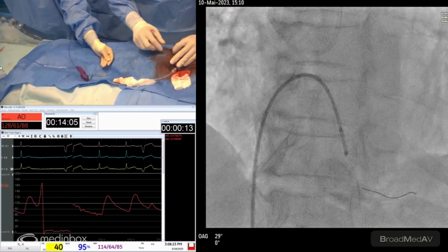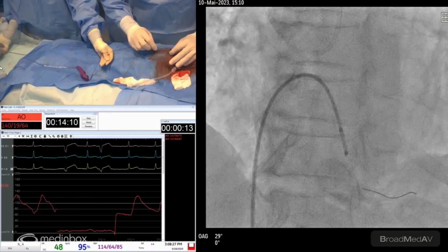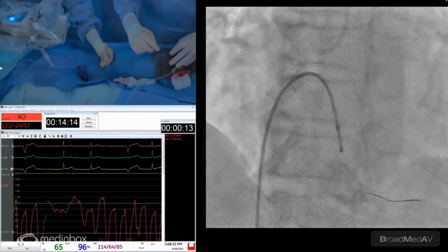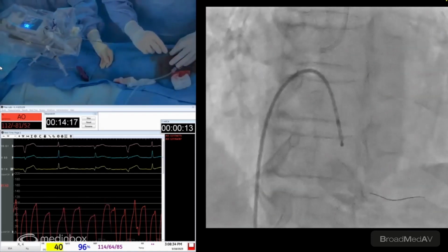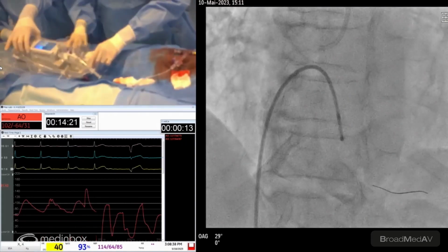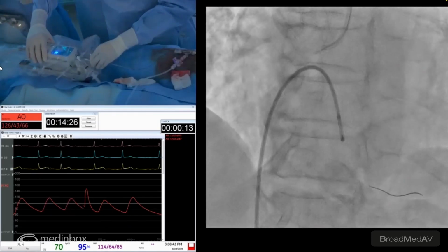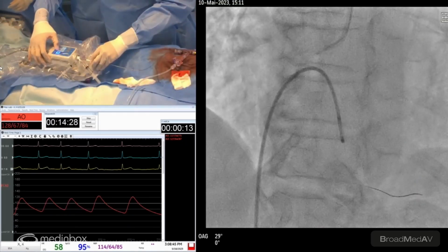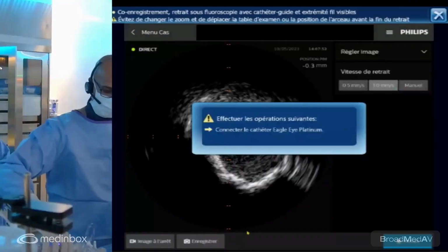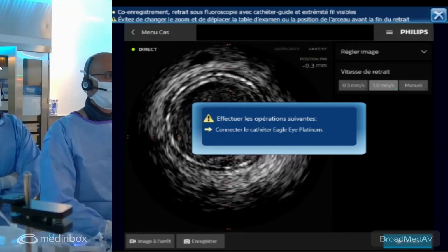So the good thing here with the long Synergy stent is that we can afford to use only one stent, 48 millimeters in length. The other thing is that we will have to consider which antithrombotic therapy we're going to give this patient. She's a high bleeding risk patient, going to be on long-term anticoagulation because of her AFib. So we'll likely give her a short timing of DAPT: DOAC, aspirin, and clopidogrel.